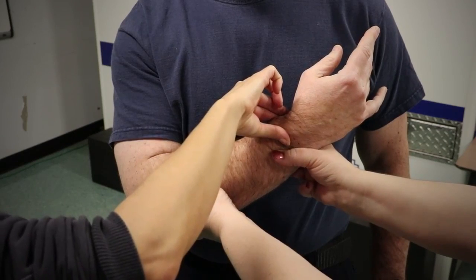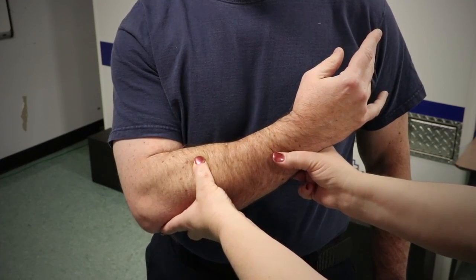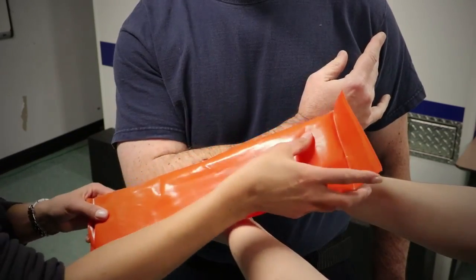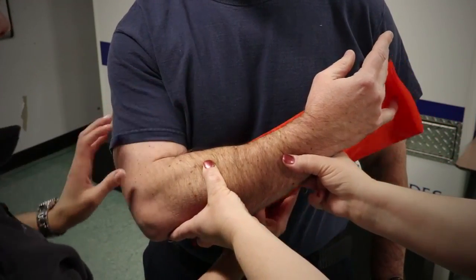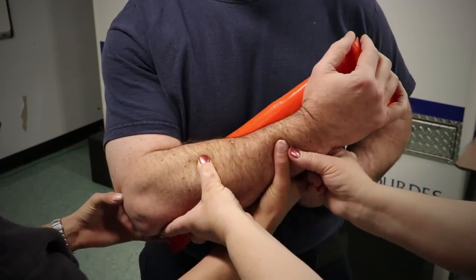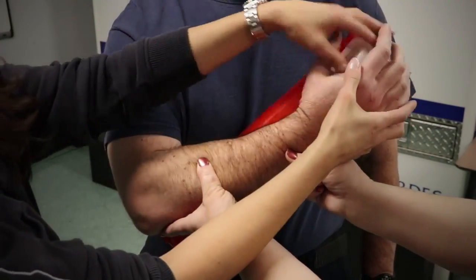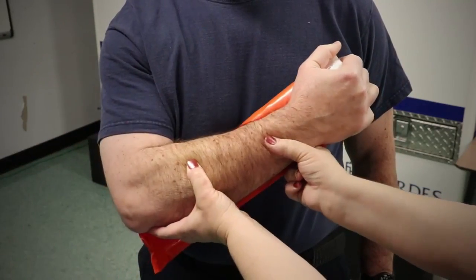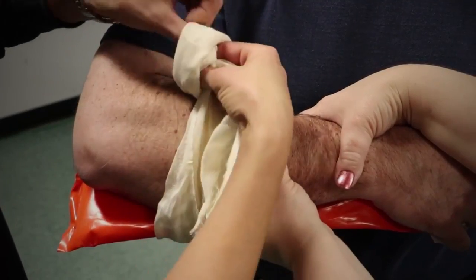Measure splint. Apply splint. Immobilizes the joint above the injury site. Immobilizes the joint below the injury site.